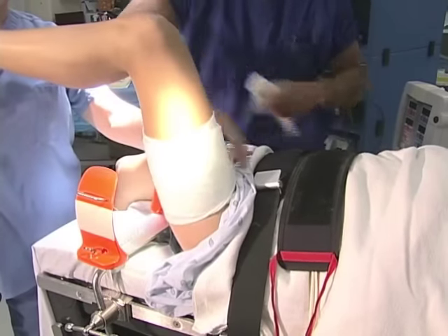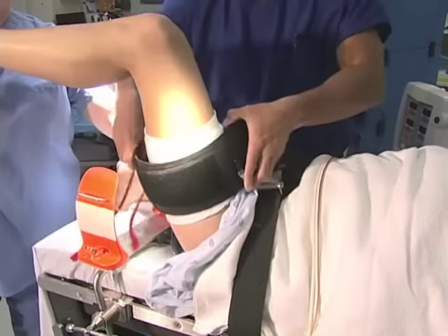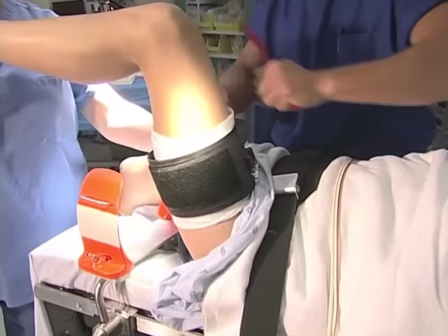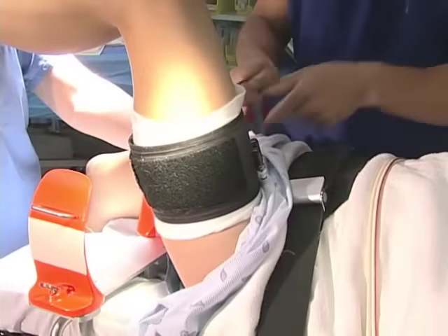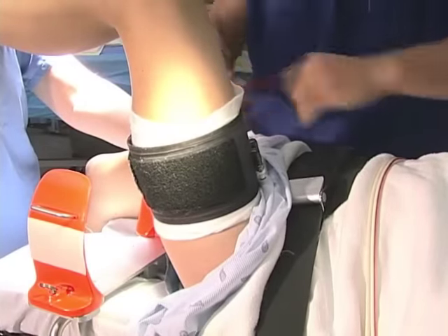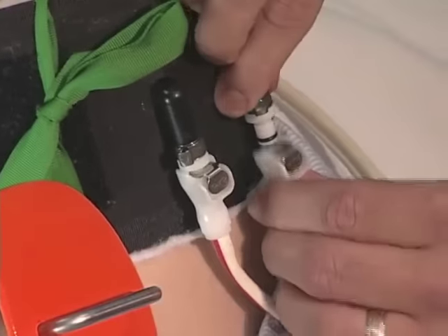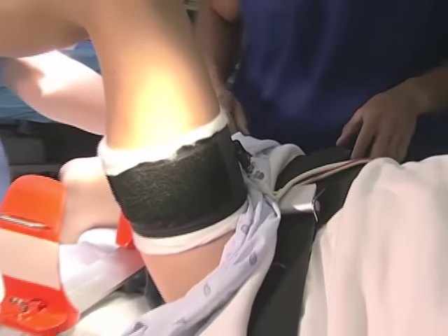Next, we will place the tourniquet. The tourniquet is held in position with Velcro, and it's important to remember to put it high enough so that after the patient is prepped and draped, it will be sufficiently proximal on the thigh to leave room to work. Generally, we'll set the pressure to 350 millimeters of mercury for a normal adult male or female.